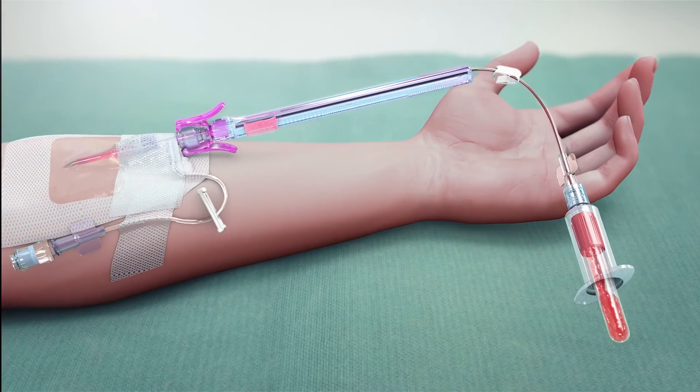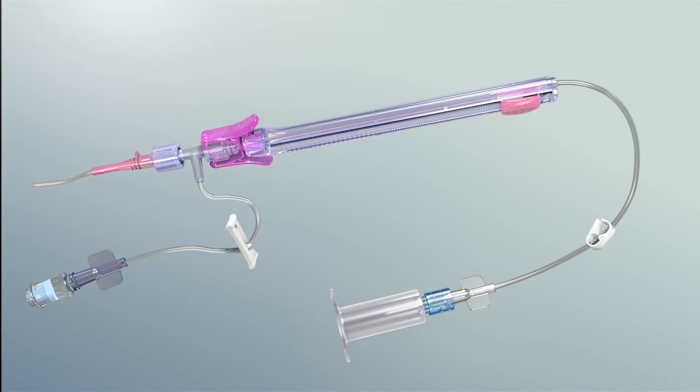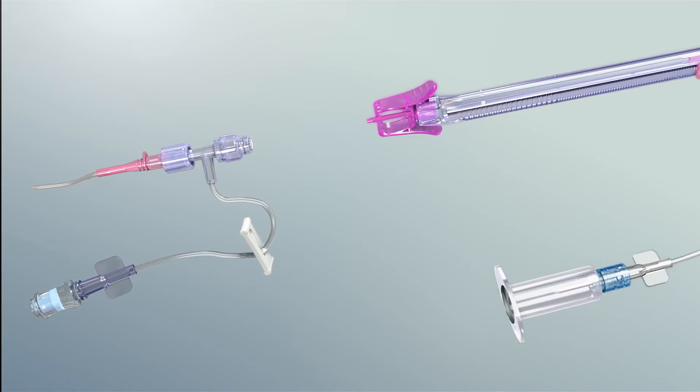Evacuated tubes or syringes are then connected to the PIVO device for collection. After collection, the PIVO device is disconnected and discarded.